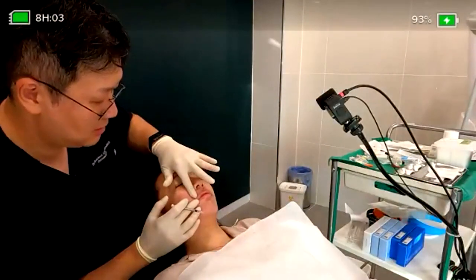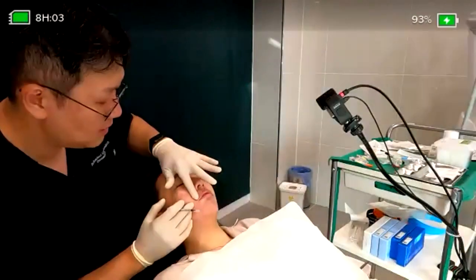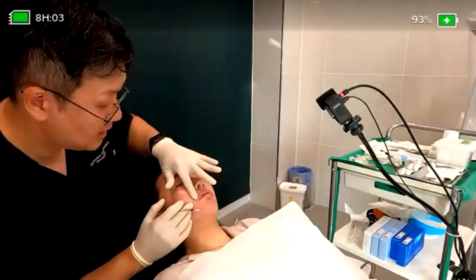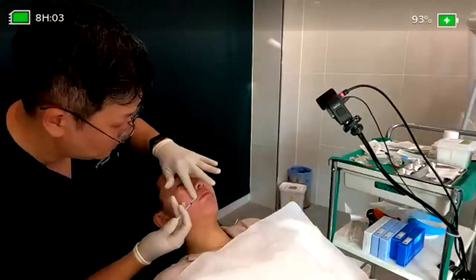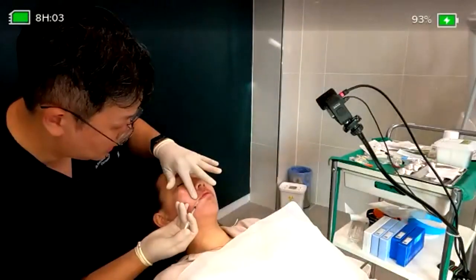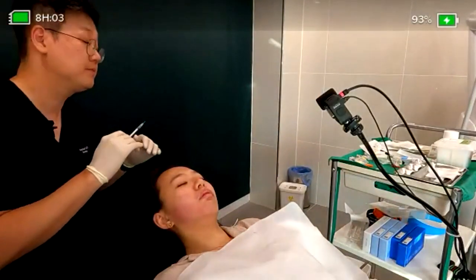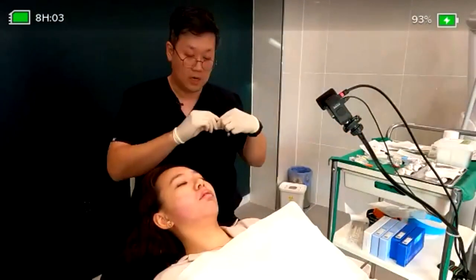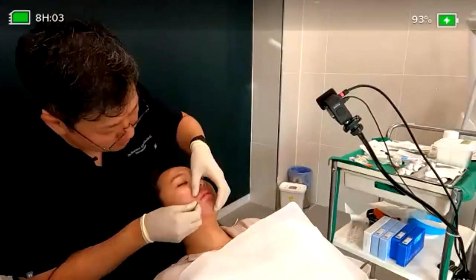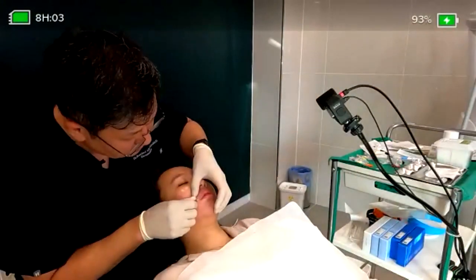And a little bit upward, pressing down, and the line changes. Injection, not making contour changes. And make a puncture here at the very side.